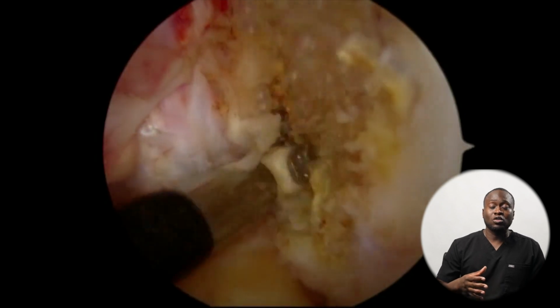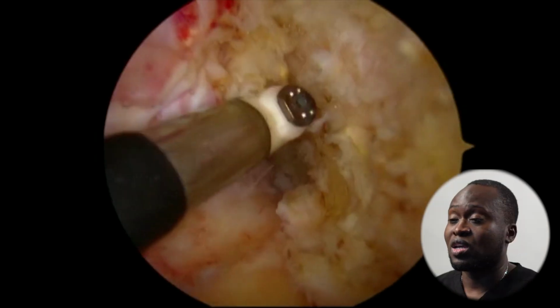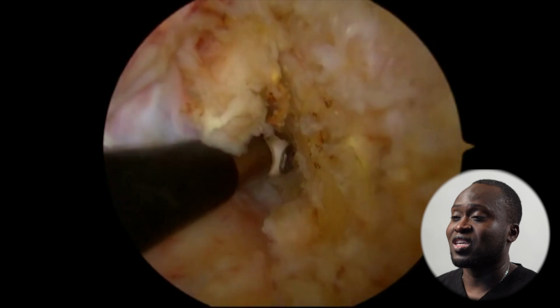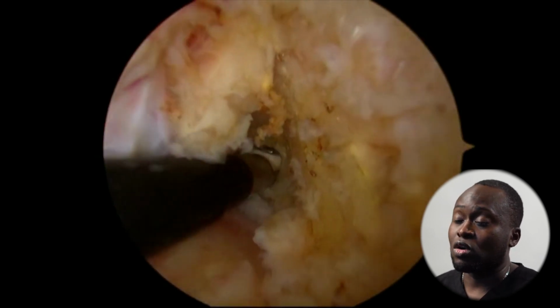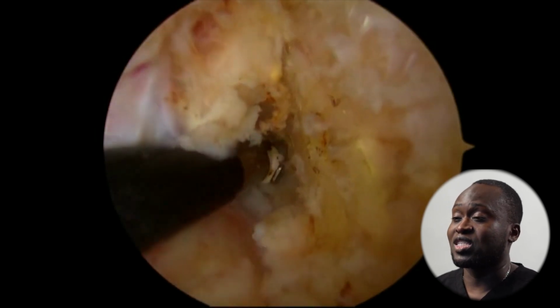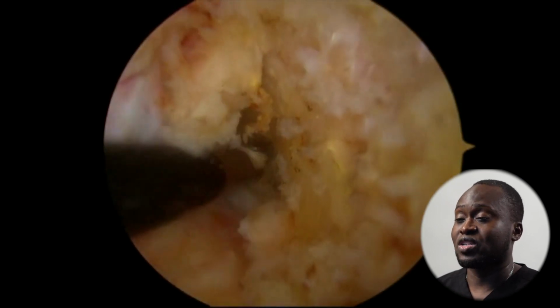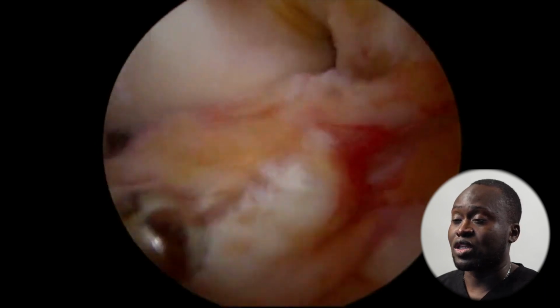The first step starts with looking around the knee with our camera, the arthroscope, and making sure everything is what we think it is. That's the diagnostic arthroscopy. Diagnostic meaning looking around and confirming everything is what we think it is. Once we've confirmed that, we're gonna then start working on cleaning up the old area where the ACL was. Now, for us to be able to successfully reconstruct that ACL, we need the old tissue, the damaged tissue, out of our way. And we use a few different kinds of instruments in there while we're doing that.